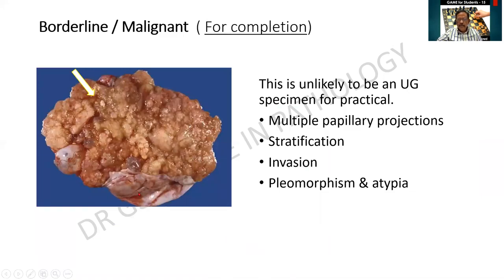And this is also a serous tumor, but then I find that it is almost showing a cauliflower-like growth. There are multiple projections. We used to call it serous papillary tumors, but in such a case, we cannot say that it is benign or malignant. In fact, it looks more malignant because there is so much crowding and it looks more solid than cystic.